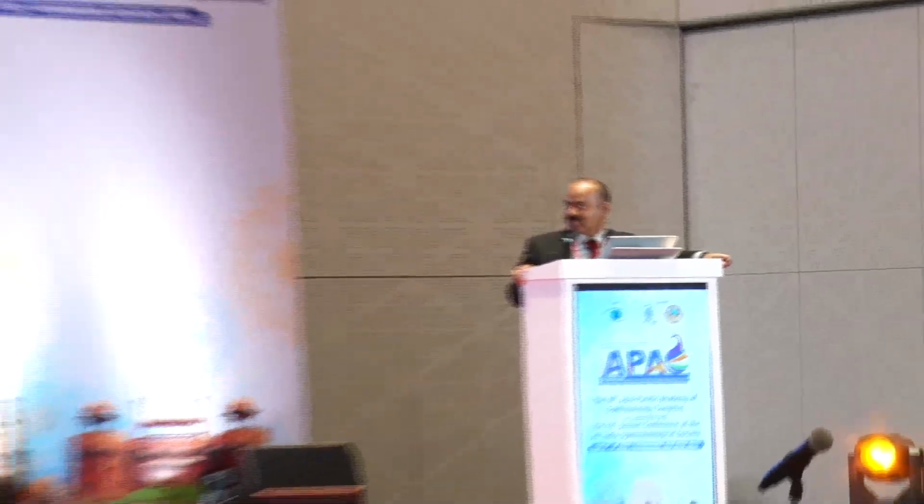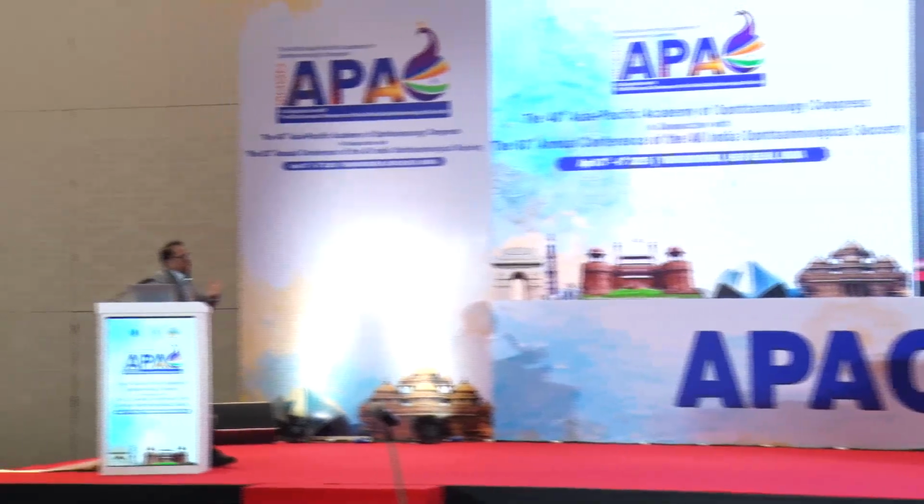The reason is, if you go to the plus side, it will flip the axis. That patient is going to be very unhappy. Very unhappy. One thing I want to mention is that in an RK patient who has developed this postoperative refractive surprise, a piggyback lens is always better, because here you can calculate the power, and if you just exchange the lens, even then you are not sure how much it's going to be.